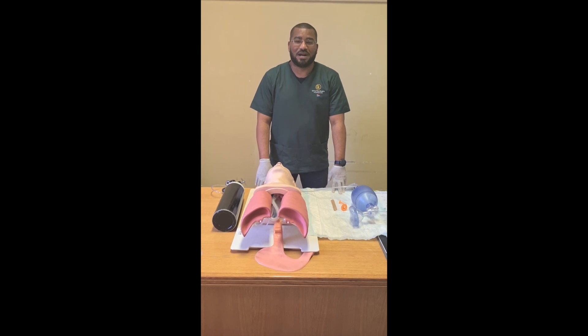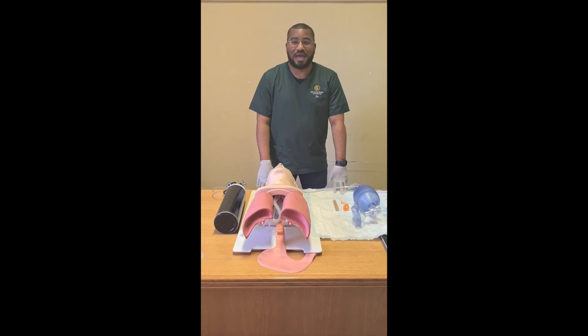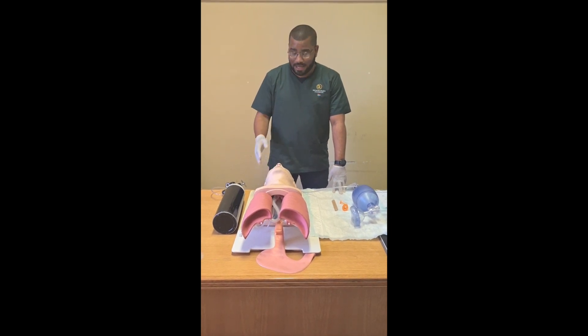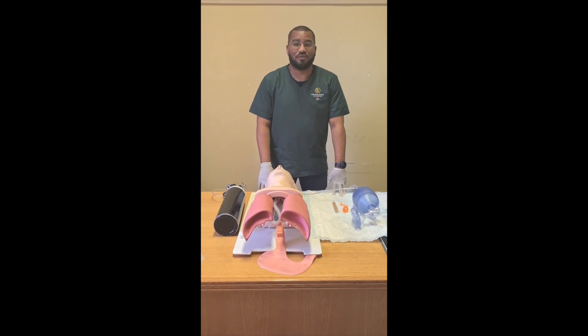Good afternoon. This is Mr. Adams from the University of the Free State Simulation Lab. Today I will be demonstrating how to effectively bag and mask ventilate an unconscious adult patient. I will start off by identifying and preparing all the equipment that is required for performing this procedure.